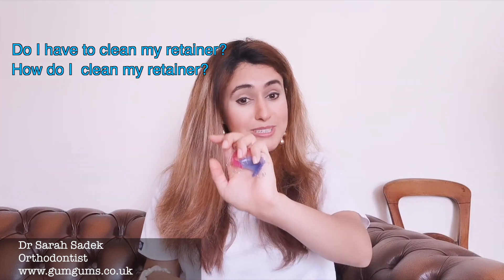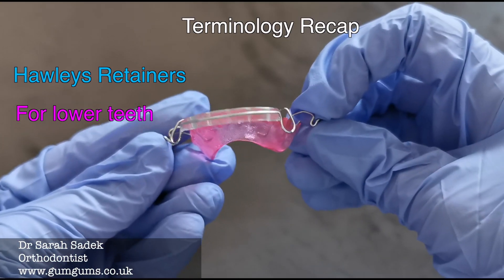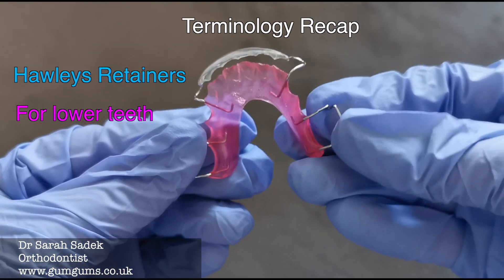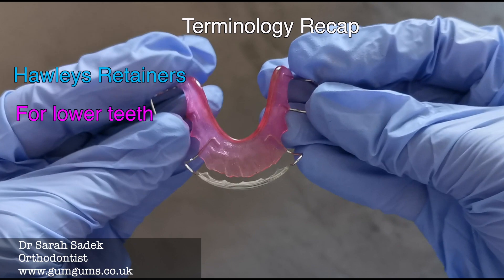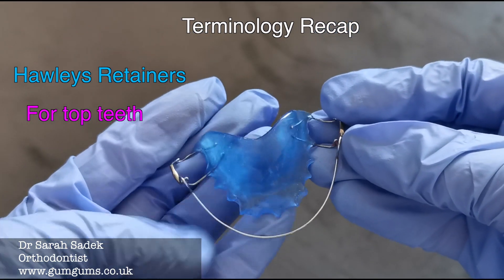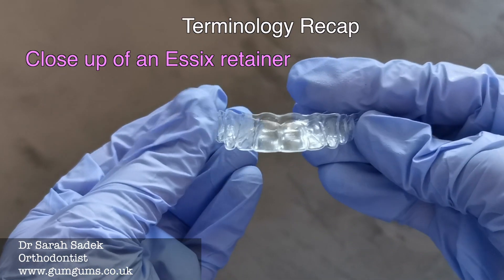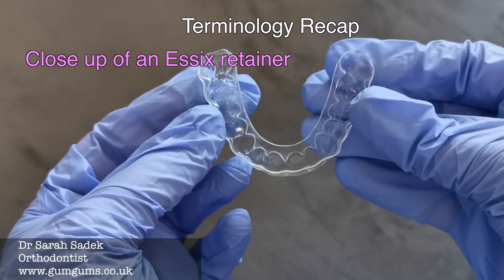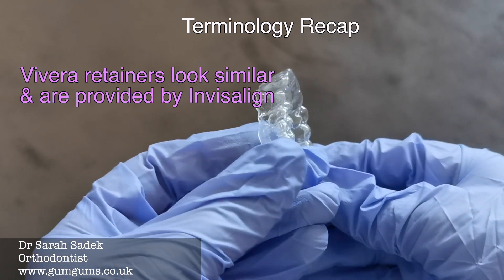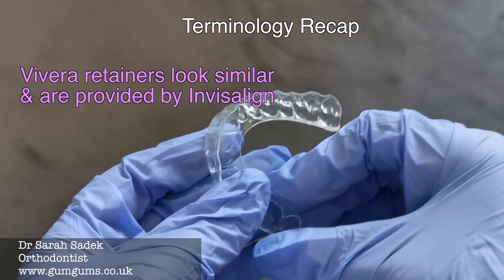I'll be covering both Hawley's retainers — here we can see a Hawley's retainer for the lower teeth, which has a little bow at the front, and this is a Hawley's retainer for the top teeth that sits in your palate and also has a bow on the front — and clear plastic retainers, which are sometimes called Essix retainers or Vivera retainers. Here we can see a close-up of an Essix retainer. Vivera retainers are very similar, however they are the type of removable retainer that Invisalign provides.